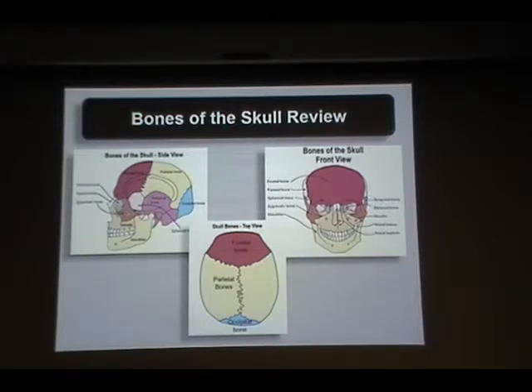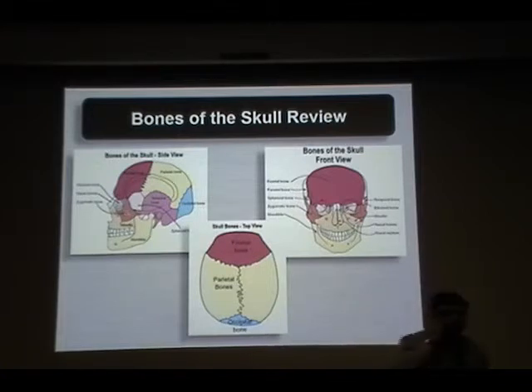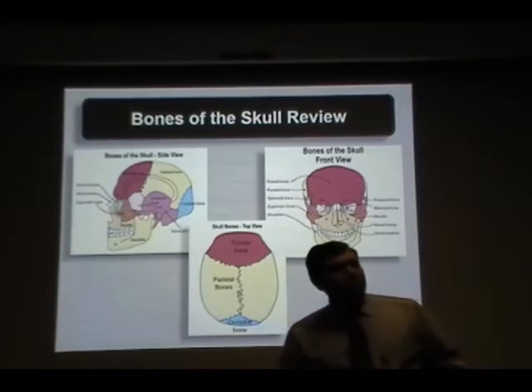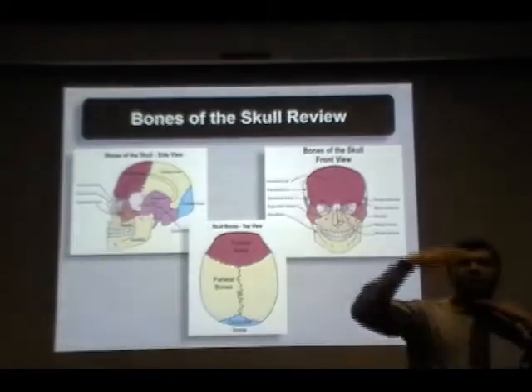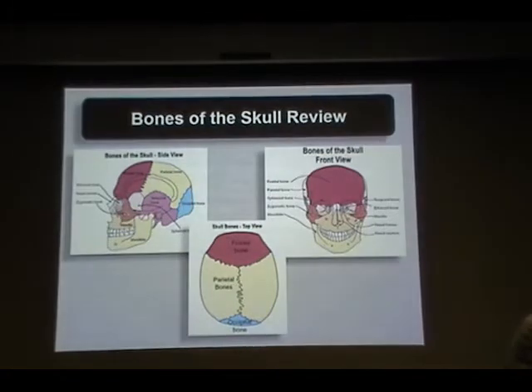But if you are going to become an endodontist, then you are concerned only with one tooth. So you don't need to know the whole of the anatomy, right? And you don't want to buy a machine that's so expensive, and it will capture all the views.